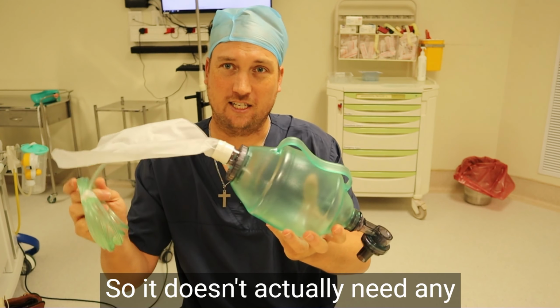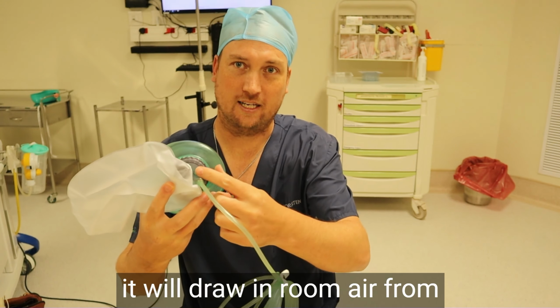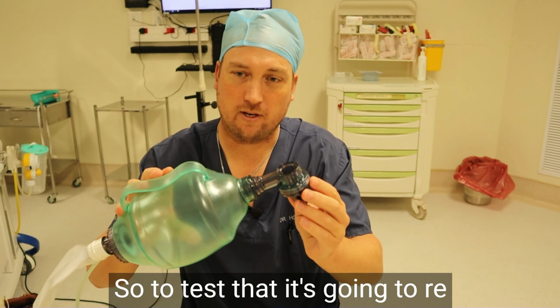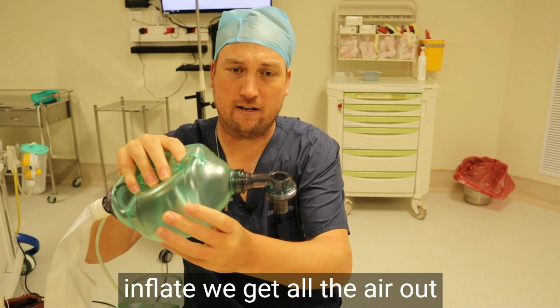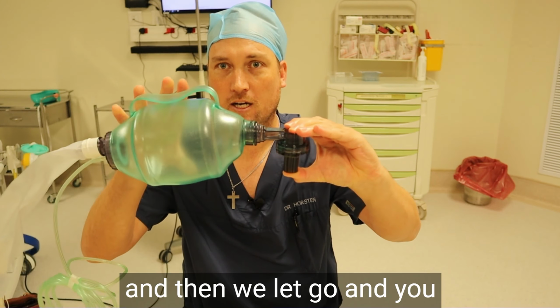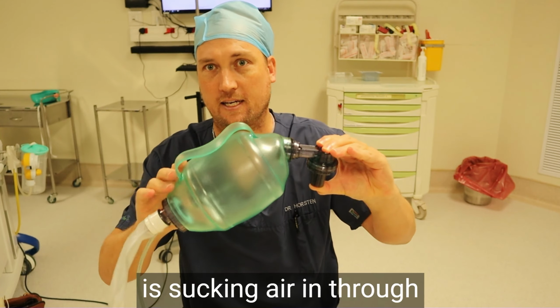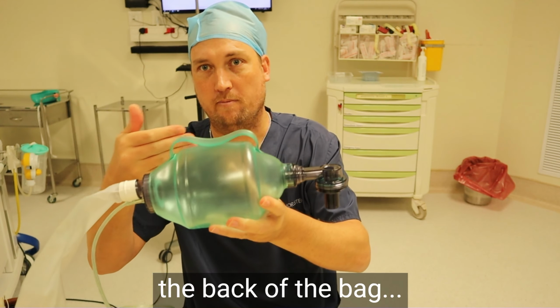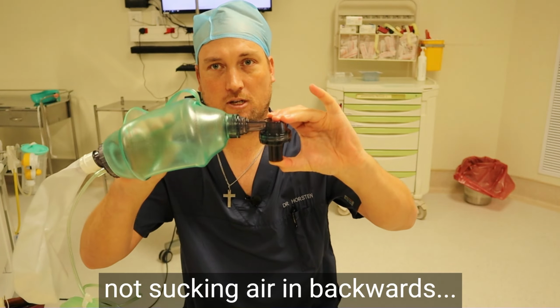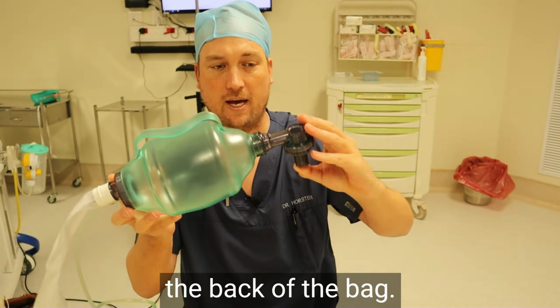So it doesn't actually need any gas going into it to reinflate. It will draw in room air from the back of the ambu bag. To test that it's going to reinflate, we get all the air out of it, we occlude the outlet, and then we let go, and you see the bag is re-expanding. That is because it is sucking air in through the back of the bag. The outlet was occluded, so it's not sucking air in backwards. It's sucking it in through the back of the bag.